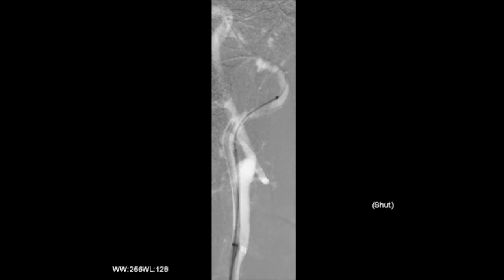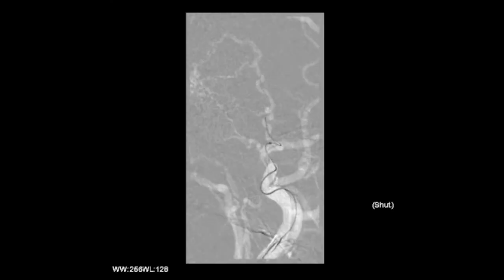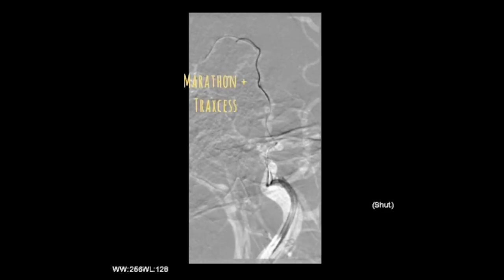As we had placed the microcatheter in the petrosal branch, there's always a worry of Onyx refluxing proximally and causing occlusion of the vital arteries supplying the cranial nerves, so it was planned for a pressure cooker technique. With a 5F Envoy placed in the distal internal maxillary artery, another microcatheter, a Marathon 1.5 French, was navigated close to the fistula site to enable deployment of coil.